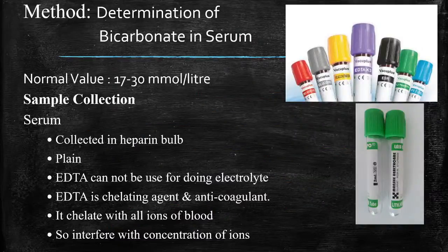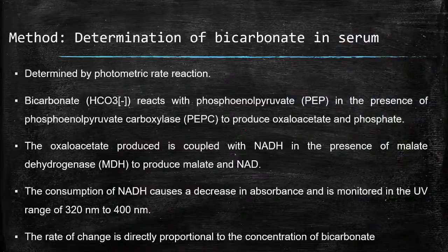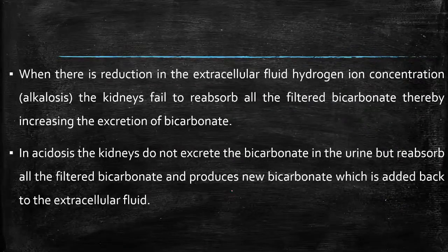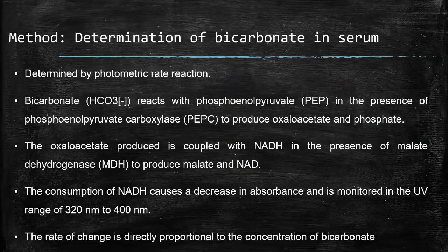Again, determination of serum bicarbonate is by ISE technique, ion selective electrode technique. Here, this is determined by photometric rate reaction.